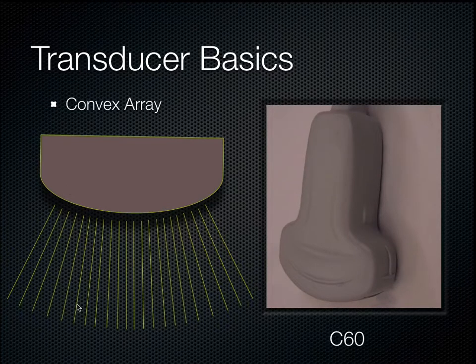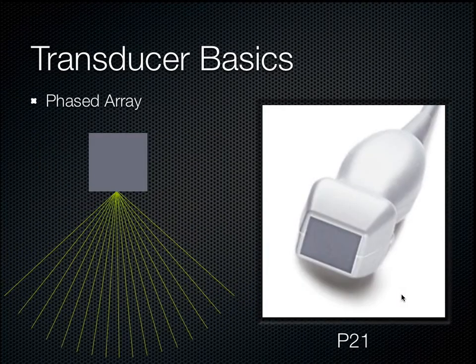In other words, I'll have these dropouts, these rib shadows down my screen, and that's why this probe is better used in the abdomen for the abdominal structures, like when looking at the aorta, the gallbladder, the kidneys, the bladder, the pelvis, transabdominal of the uterus, that kind of stuff. Whereas this transducer is really designed to look between the ribs, looking at the heart and the lungs.